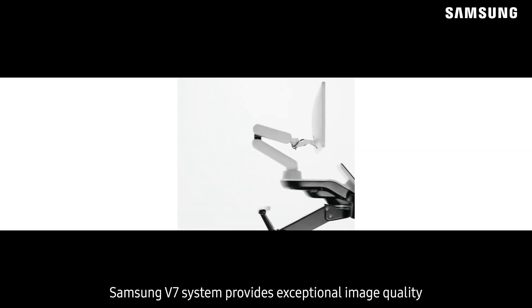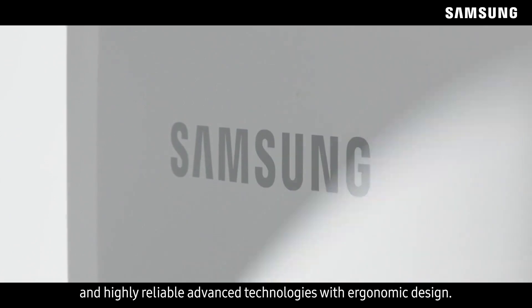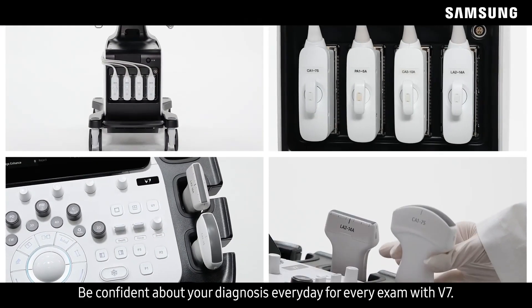Samsung V7 provides exceptional image quality and highly reliable advanced technologies with ergonomic design. Be confident about your diagnosis every day for every exam with V7.